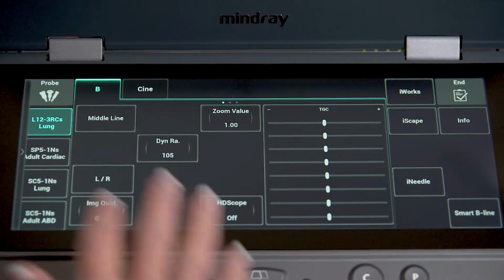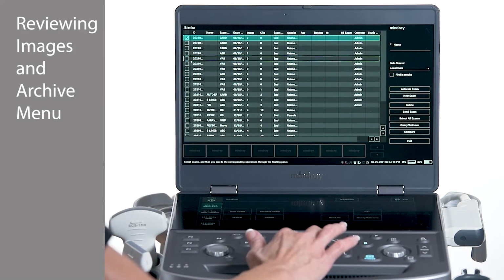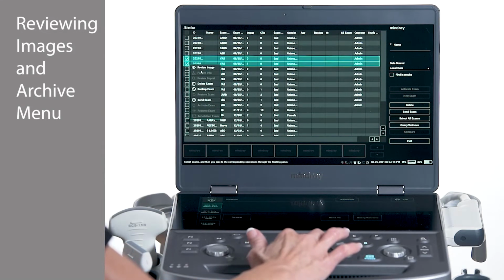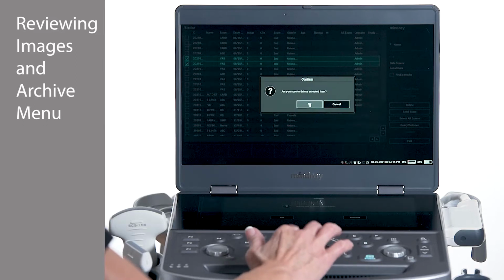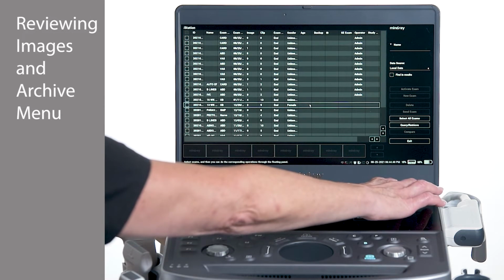To delete studies from the iStation archive, highlight desired exams, leaving the most recent exam unselected, then select Delete from the drop-down menu. An application specialist may set up the auto-delete feature, if desired, to ensure the hard drive will never get too full. Auto-delete allows for a set number of exams to remain within iStation. Once iStation reaches the selected number, oldest exams will start to automatically delete from the archive. Please note that once an exam is deleted through the auto-delete feature, there is no way to retrieve it.